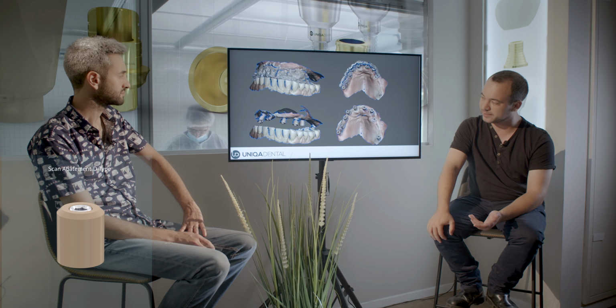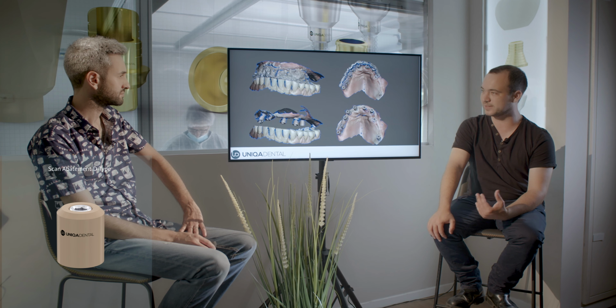For example, in here you can see we took interocclusal relations using the CAD CAM technology. Now, what does the CAD CAM technology give us that we didn't have previously? First of all, we're having here scan abutments. Doesn't matter right now on what type of parts we have the scan abutments, but we want to have these kind of abutments on the upper jaw, and we want to have them in relation to the lower jaw.